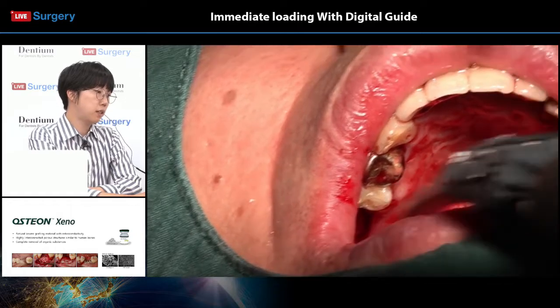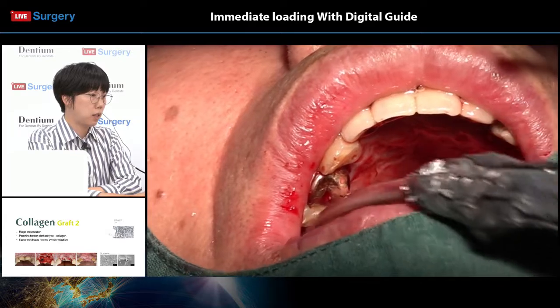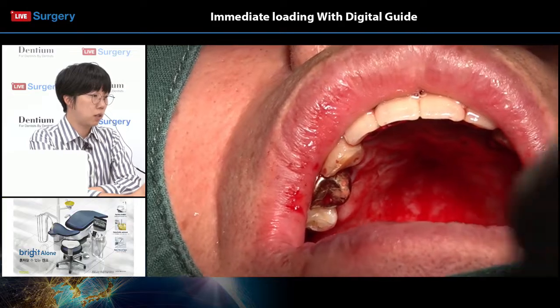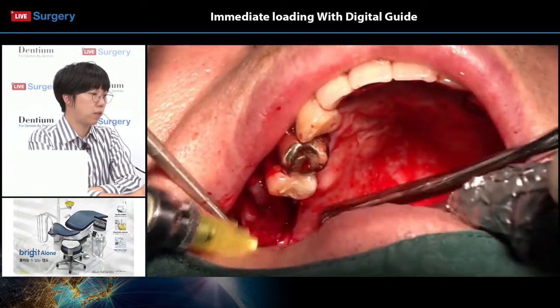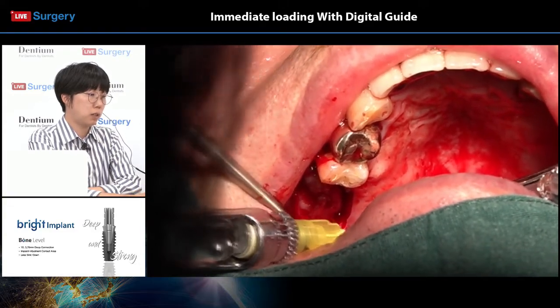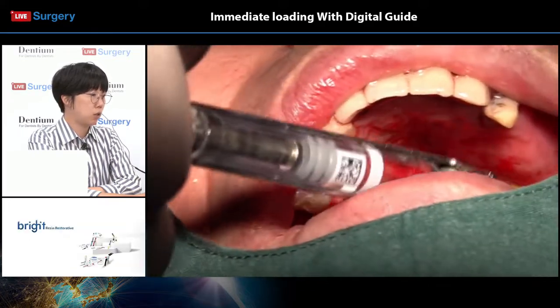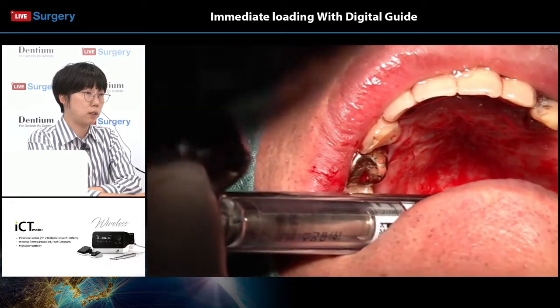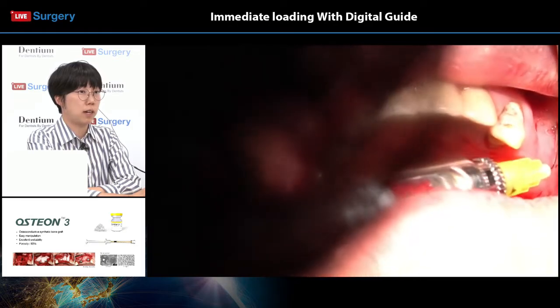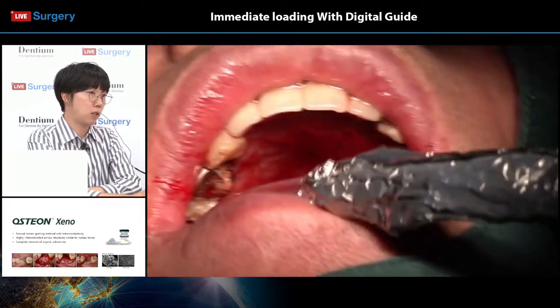So in cases like this where there is a lot of bleeding, the surgeon's view can be limited and can lead to insufficient drilling or misplacement of the implant fixtures. In such situations, we can always retrieve the former implant and perform additional drilling or finish implant placement using the conventional method. So freehand surgery training is very, very important. We must never put 100% of our confidence into the guide itself, but always have a backup plan with a freehand surgery method.